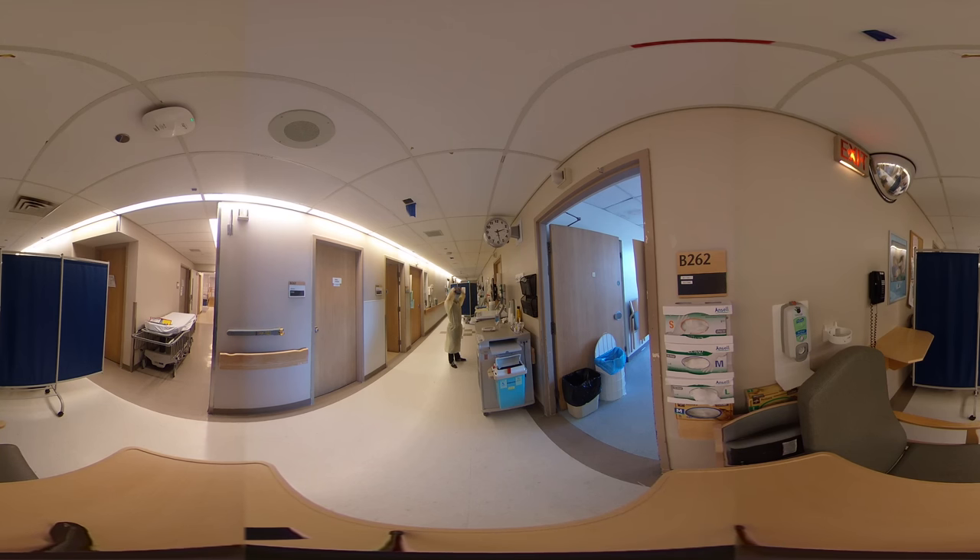I'll put on the visor, and then put on my gloves, making sure that I keep the sleeve over my palm, holding it down with my fingers to keep it tucked under the gloves. And now I'm ready to do my medication administration.